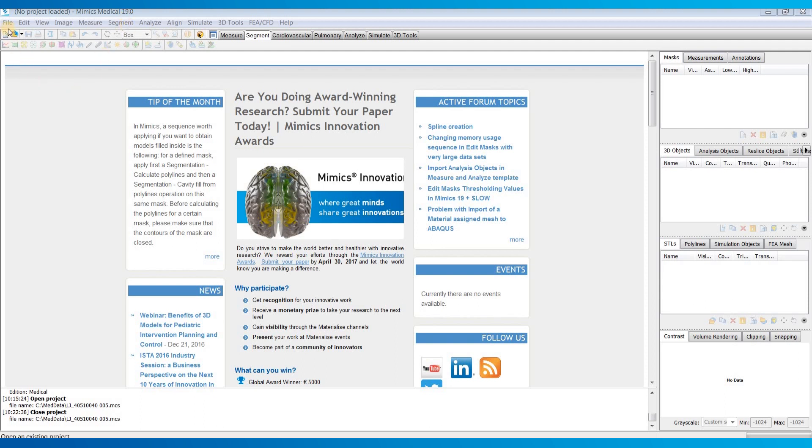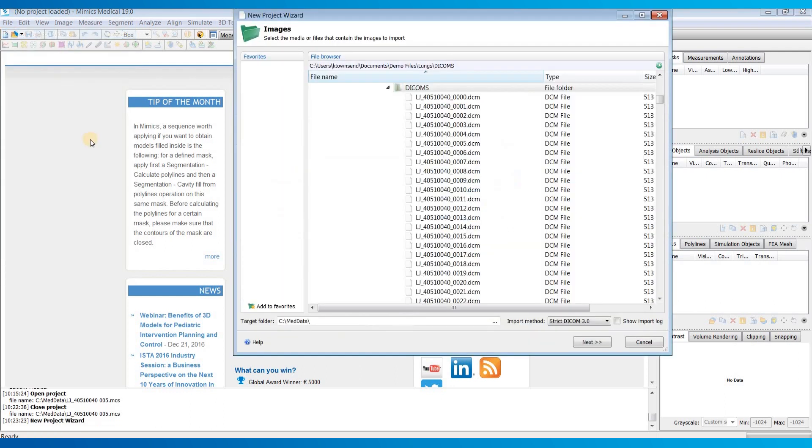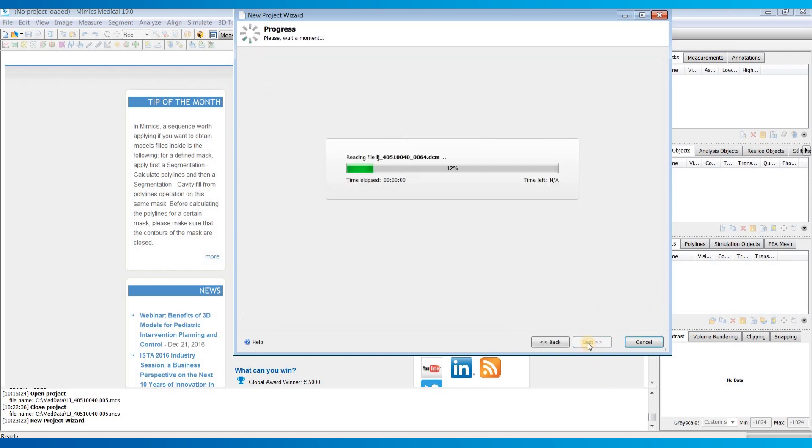So first thing I'll do is go to the file menu and go to new project wizard to import my raw DICOM images. This will bring up this dialog box where I can select the parent DICOM folder that contains all of my images. And then I'm going to hit next.